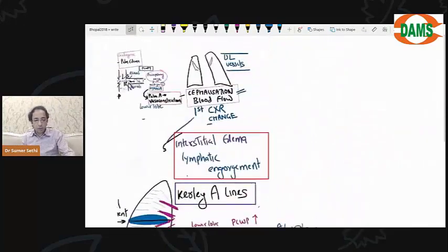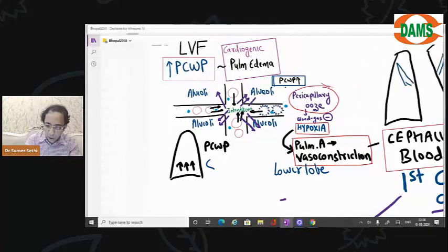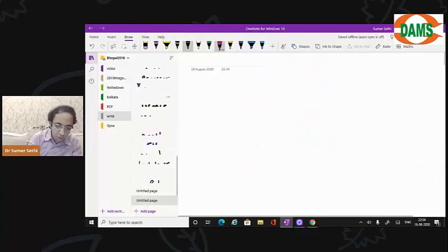So I can see now we have made a concept. I will teach you how to look at an X-ray also, but we have made a concept of how to identify heart failure on X-ray. Because as an MBBS doctor, if you don't know how to see heart failure, you will not feel good about yourself. Okay, my question to you is this, beta.